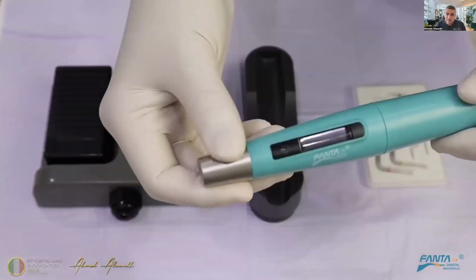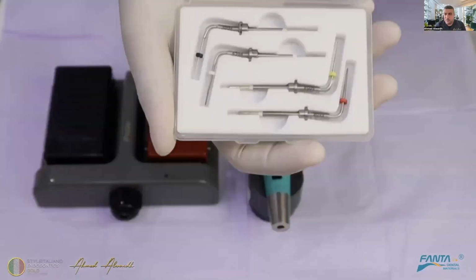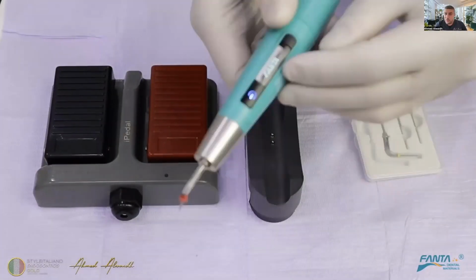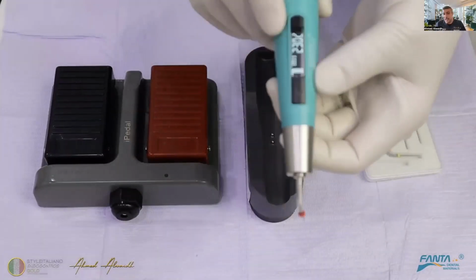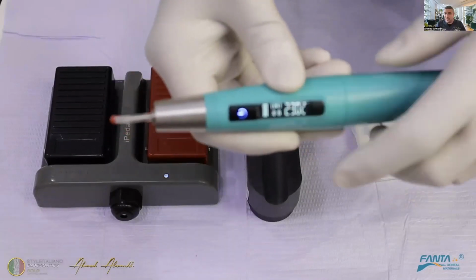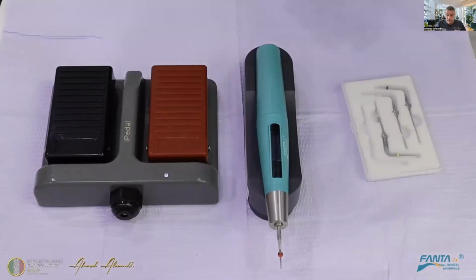This is the device by Fanta. This is how it comes, and also with the wireless control. So it has different options for the temperature you want, and different tip sizes according to the root canal you're working with, and in each canal you need to check the tip before obturating. Okay, and this is the light, and also this is the wireless foot pedal with which you can activate the heat without being busy with your finger. You can use your foot, which is very, very nice, and which I really like.